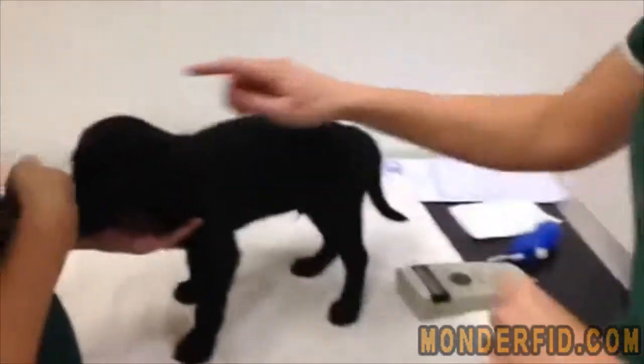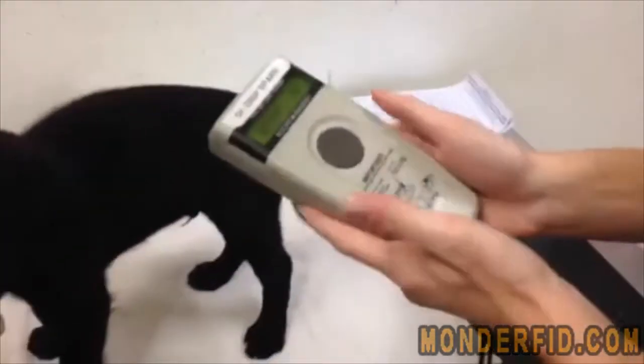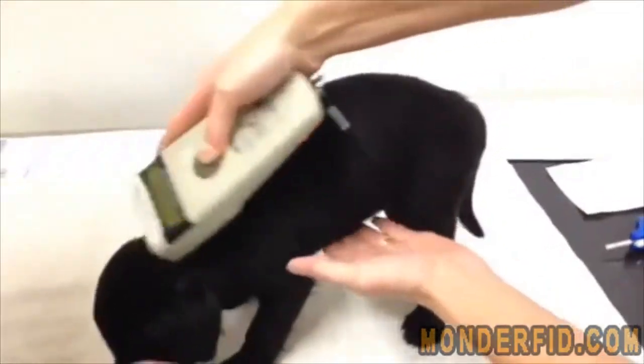Today we're going to microchip this little pup. Always start by scanning the dog before you begin, to make sure there's no other microchip already present. Here's the scanner — just scan the dog all over to check.